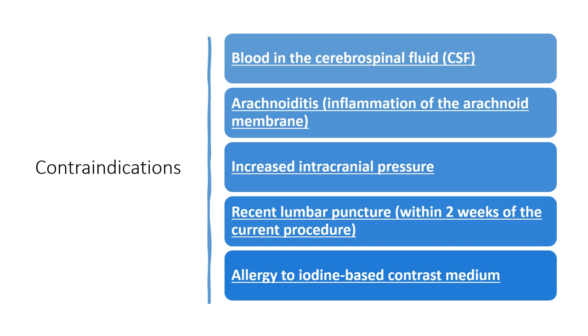Increased intracranial pressure: tapping of the subarachnoid space with a needle insertion may cause severe complications to the patient as the pressure equalizes between the areas of the brain and spinal cord. A recent lumbar puncture within 2 weeks of the current procedure: performing myelography on a patient who has had a recent lumbar puncture may result in extravasation of the contrast medium outside the subarachnoid space through the hole left by the previous puncture. An allergy to iodine-based contrast medium.